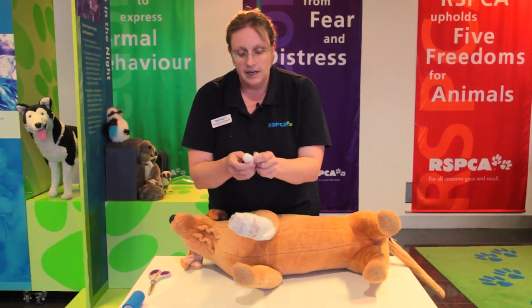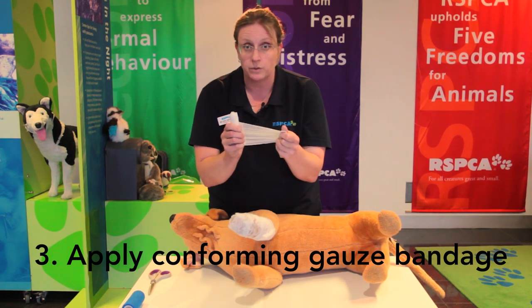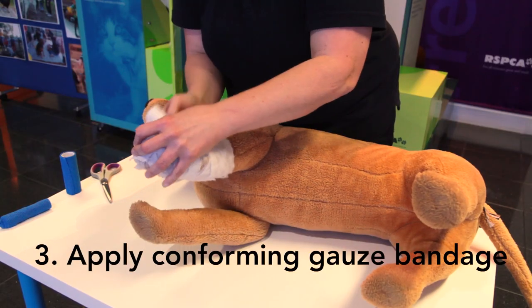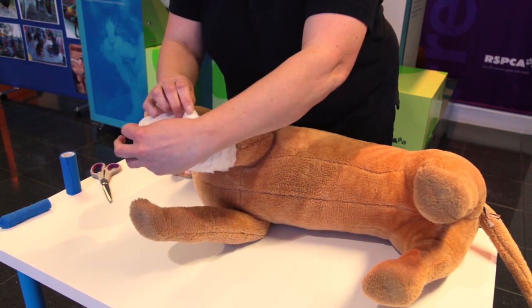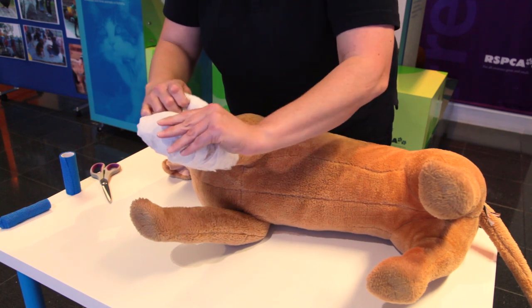The next layer is the compression layer — this is a conforming gauze that's a bit stretchy and puts pressure on the wound to stop the bleeding. We're going to start at the paw and make sure the paw is evenly covered. This can be a bit tricky and takes practice — you need to fold the bandage and make sure there are no big lumps and bumps that could be uncomfortable for the animal.